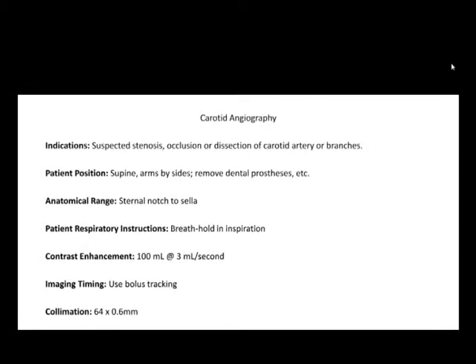One of the carotid arteries, or I know a lot of patients typically put it at the aortic arch, somewhere around there, so that you can pretty much time it and set a delay so that you can be sure that the carotid arteries are enhanced as they ascend up the neck.